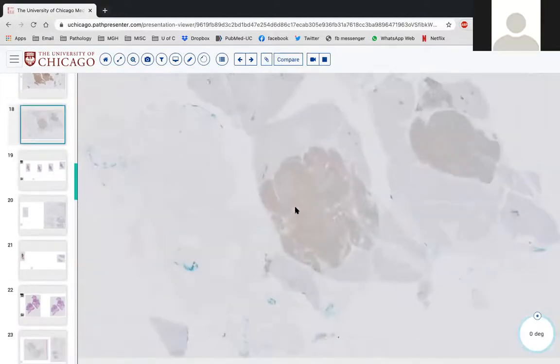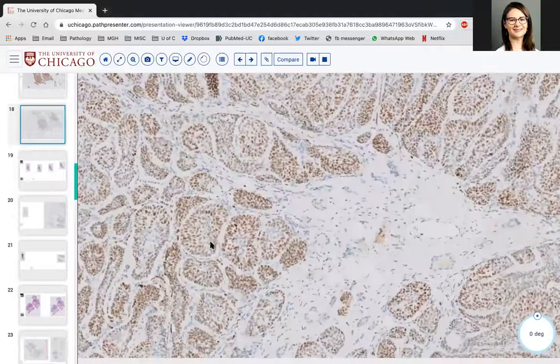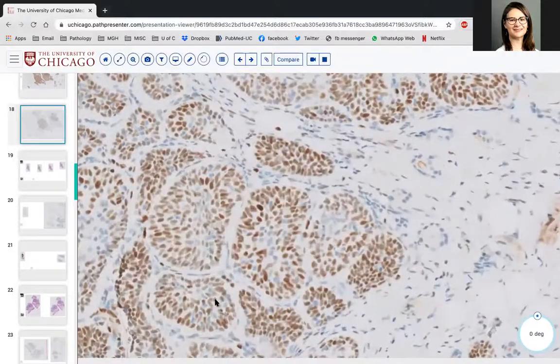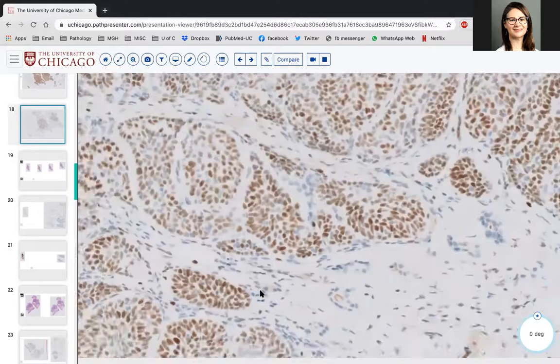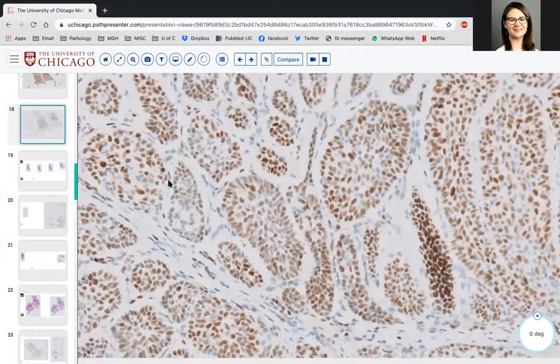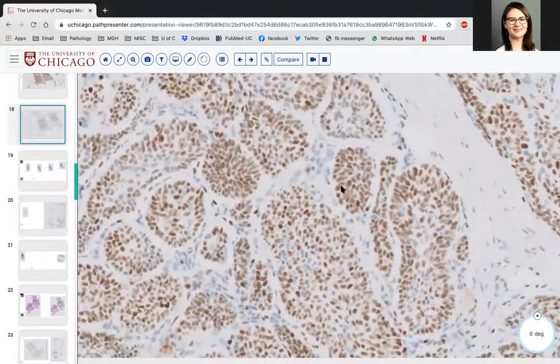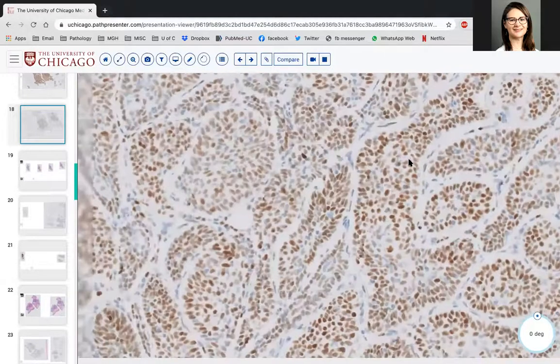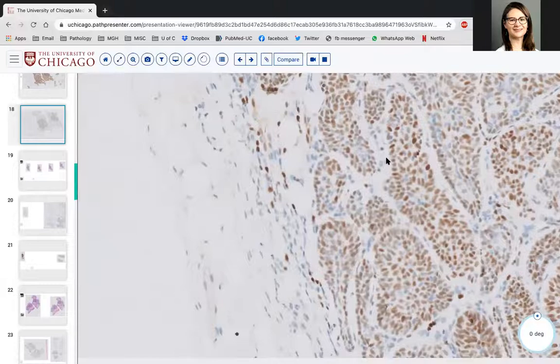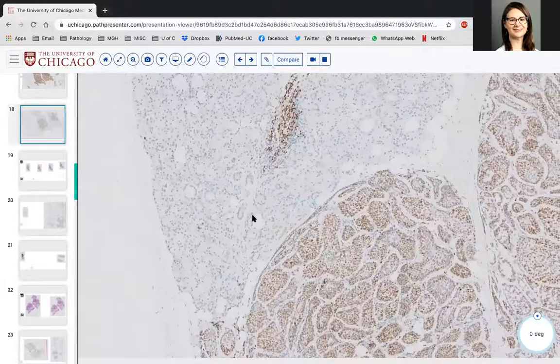The LEF one. Right, so this is the LEF one, which in fact is nuclear positive, highlighting not only the peripheral, but some of the central cells as well. I haven't had as much experience with the LEF one, because for salivary, it's a relatively new concept. So if we have these kinds of tumors, we'll try it out and see what things look like. But at least there is some LEF1 staining that theoretically could support your diagnosis.